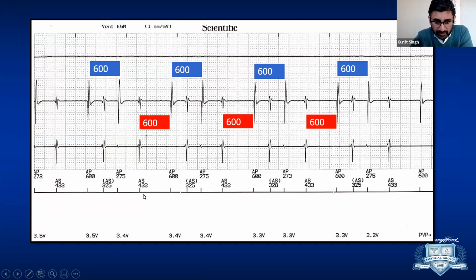And the reason it's not happening is because the pacemaker is sensing something. Because remember, you are pacing in AAI mode. If you see something, you are not going to pace. So this is an example showing you the far field signal, again, crosstalk from the ventricular being sensed on the atrial channel. And that's the reason you cannot complete your threshold testing. So to complete this threshold testing, what would you do?